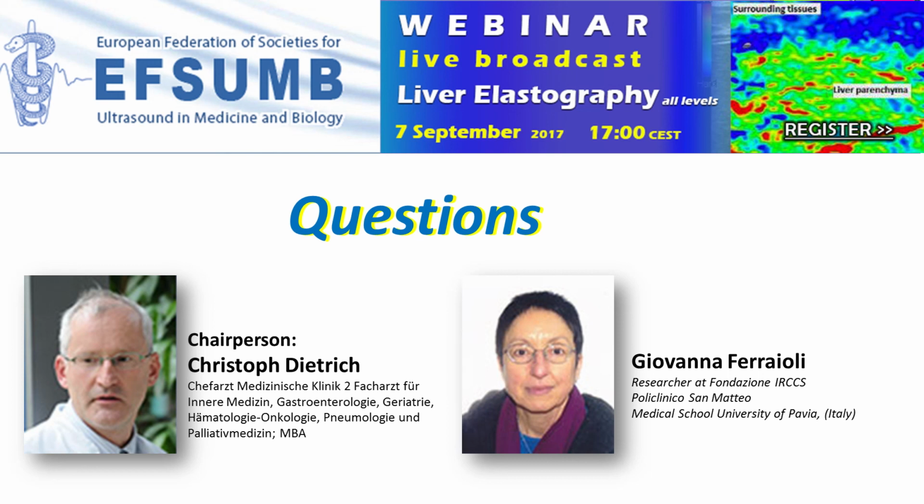May I answer the question from my point of view, and also looking at the literature, the assessment of focal liver lesions using elastography has given conflicting results. So sometimes there's an increase of stiffness of the lesion, sometimes a decrease of the stiffness. This is a field still open to research, and we are looking forward to the literature.